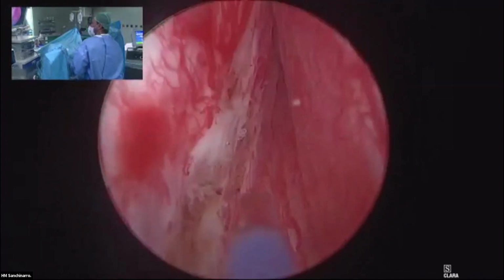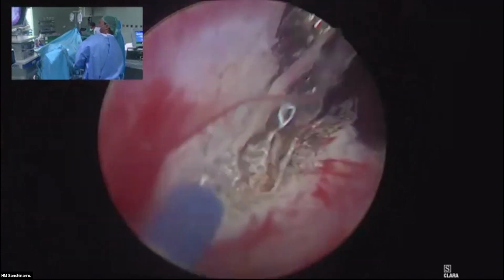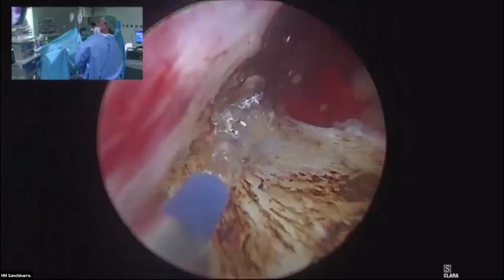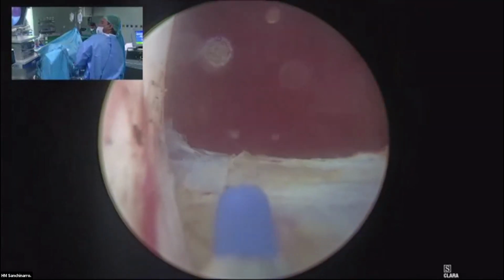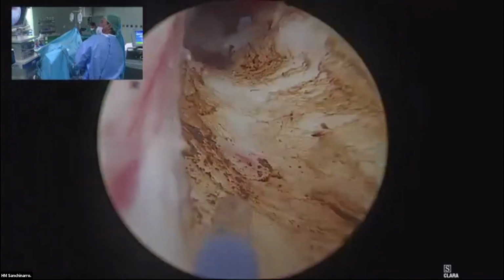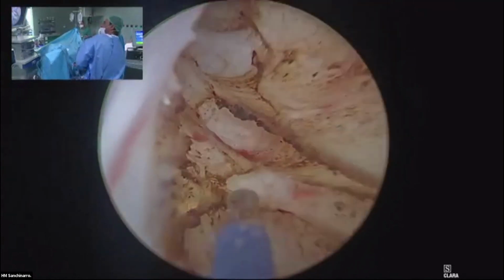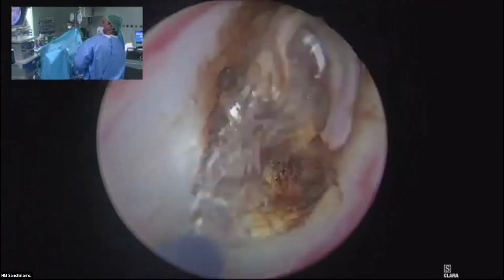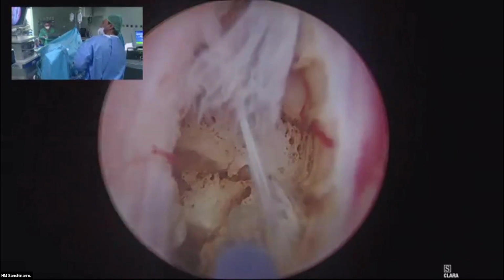So after that, in this prostate, we don't have a huge third lobe, but I always recommend to make the third lobe at all, just to have a good separation in between the capsule and the adenoma at 6 o'clock. So I'm doing this 7 o'clock incision just to detach the median lobe from the lateral lobe. And I'm doing it with the zigzag just to have, even here, a U-shaped incision, just to have space to move in between with my instruments. And I'm going just towards my U-shaped incision at the verum montanum.